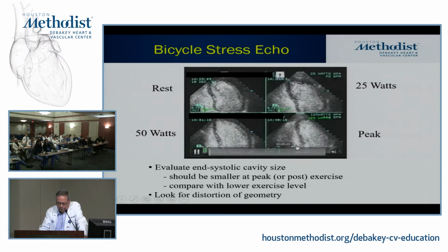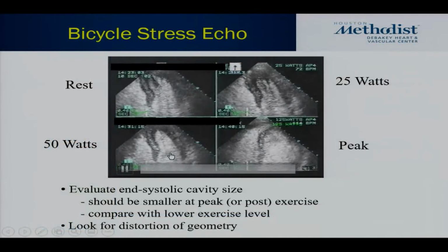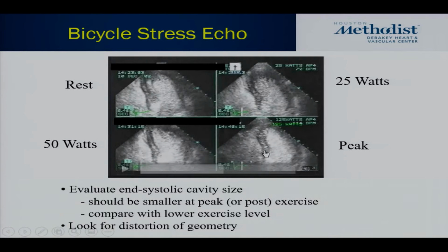So you may be right. Let me see if I can stop. There we go. All right. Now, the cavity is still relatively small here, and everything moved in here. Look at that end systole. Unfortunately, I cannot show them together because obviously the intervals have changed. So that's your end systole at rest, and that's your end systole with exercise. So you are right. There may be a little bit of dilation here, but where is the most dramatic dilation? Yeah, at the base.